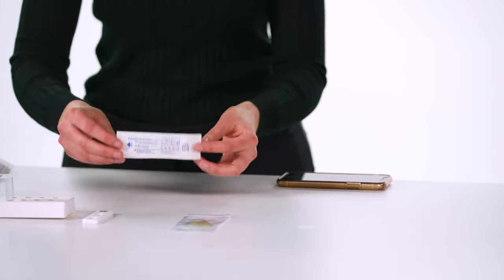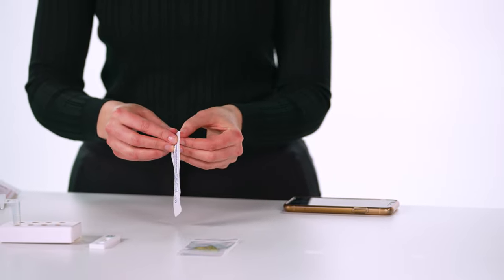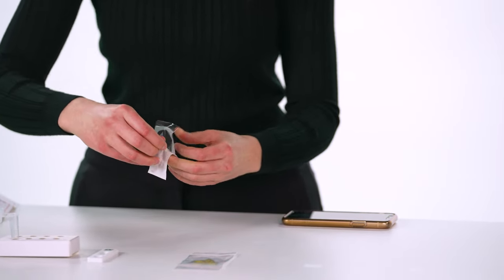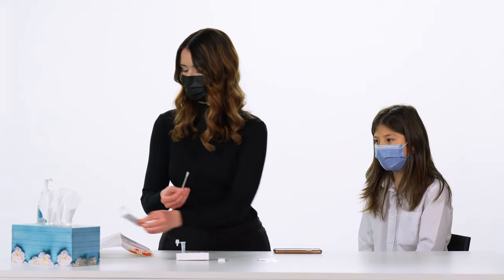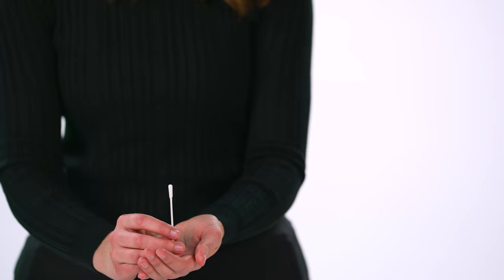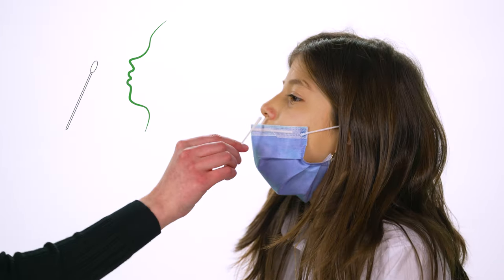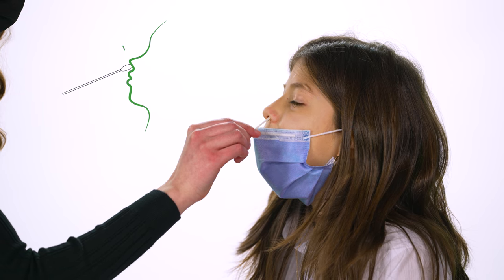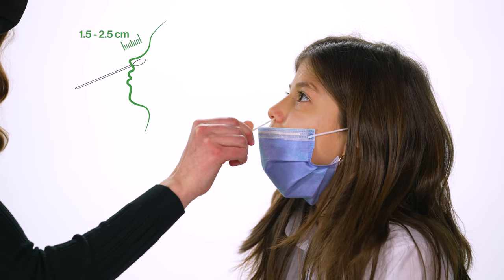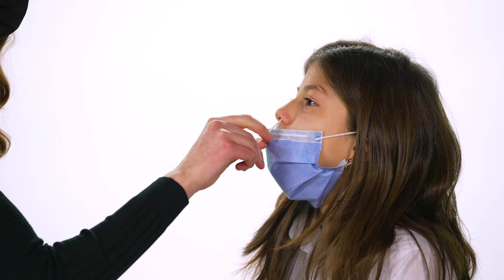Then both you and the child should wash or sanitize your hands. Check that the swab wrapper is properly sealed. When you are ready to use the swab, peel open the packaging from the indicated end and hold the swab by the stem. Do not touch the padded tip of the swab to yourself or any surface. While the child is still, insert the swab about one and a half to two and a half centimeters — a half inch to one inch — into their nostril until you feel some resistance. Be conscious that the depth for swabbing a child may be less than the depth for an adult.